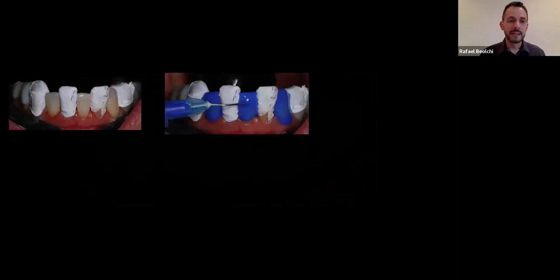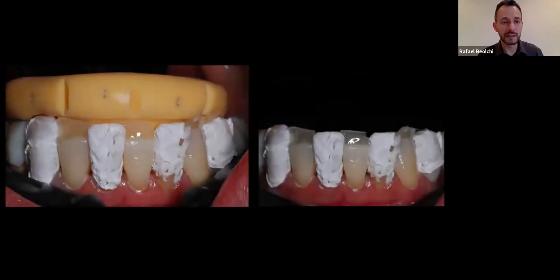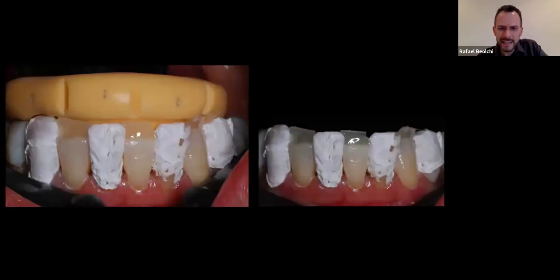Okay. So now I'm going to do the other teeth that I left behind. I already did some finishing on the proximals, so our life is a little easier. It's important if you can do some markings. It helps you in knowing where the teeth should be, because again, they're too narrow. And I did exactly the same thing, guys, so I'm not going to go through the whole sequence: lingual, proximals, dentin, enamel, polishing, sealing.